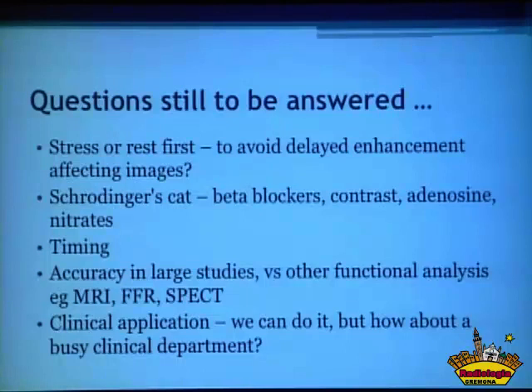Then the issue of timing. Our protocol uses a one-shot snapshot, 70-80% window. We get about 9 or 10 images to compare within that snapshot, but that's only over about a couple of 100 milliseconds, so we really have to be sure we're getting it at the right time and have a way to do that robustly.